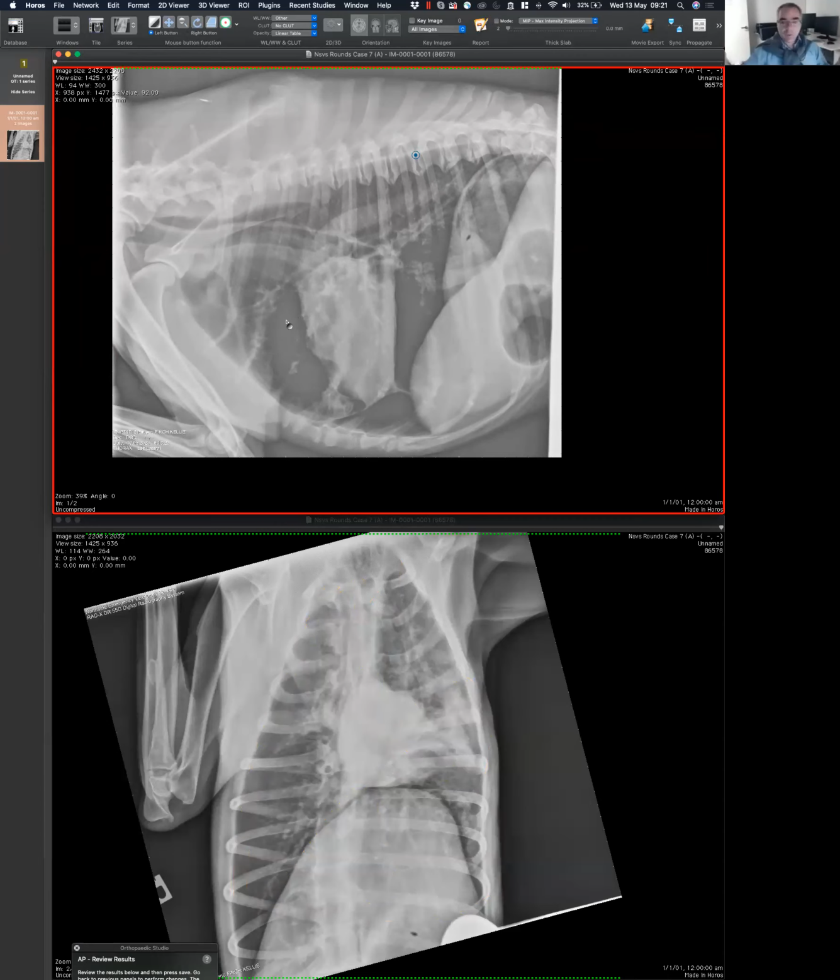So when we overexpose, things that are small are lost, but if you have bone, you can still see it. Makes sense, because now you are at that level of exposure that some x-rays are going to be stopped. But obviously there are so many x-rays going through the vessels as well as through the lung without creating that differential absorption. Okay, so I'm going to put myself into arguing with myself, make sense?